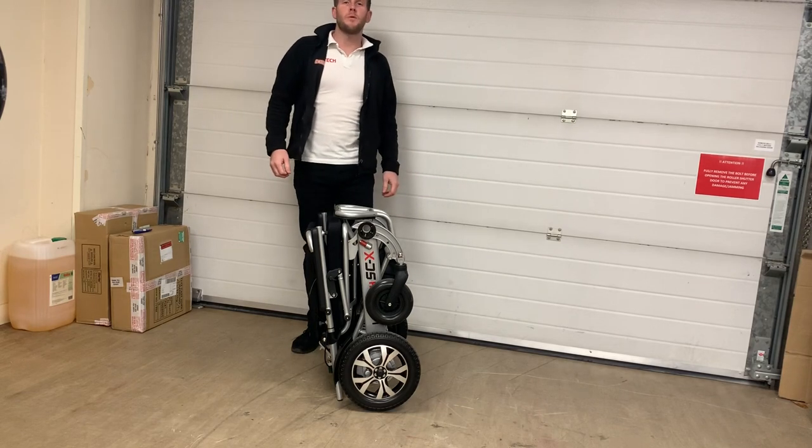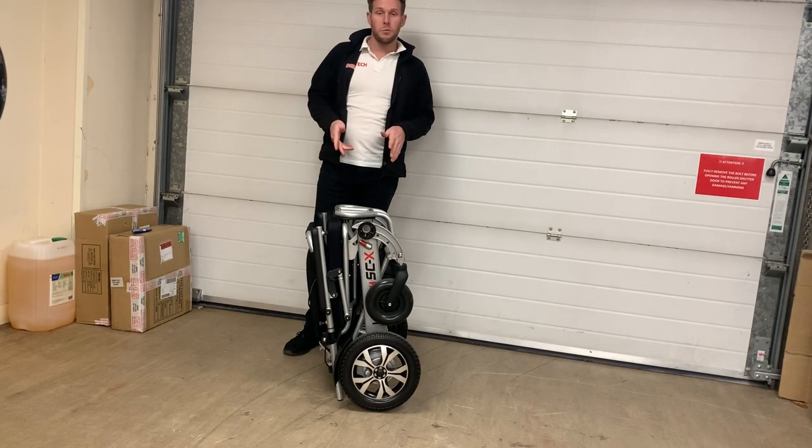So I'm Toby from Lifetech Mobility. Today we're going to be talking about our latest chair, the Smartchair X.